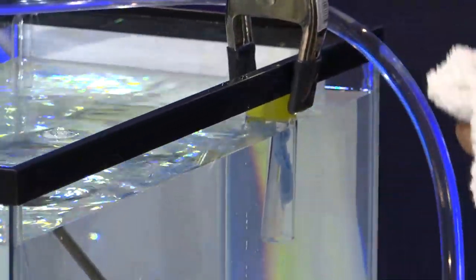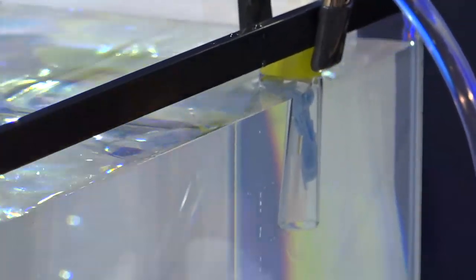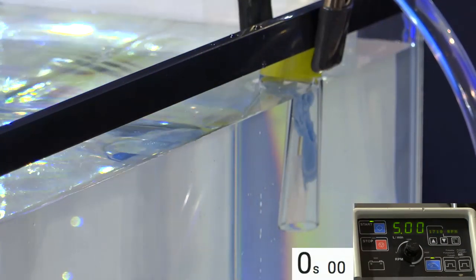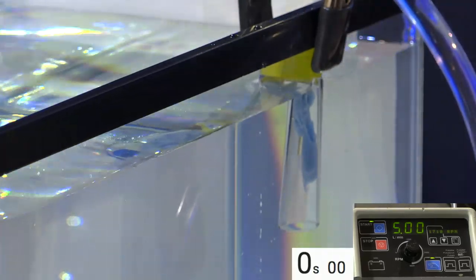Now, you have that primed up real good? Because I could prime it a little more, just to be sure. Yep. Got the air out. Air's out. Okay. I'll clamp that now. All right. So what we're gonna do is we're gonna have Stephanie bring it over here.